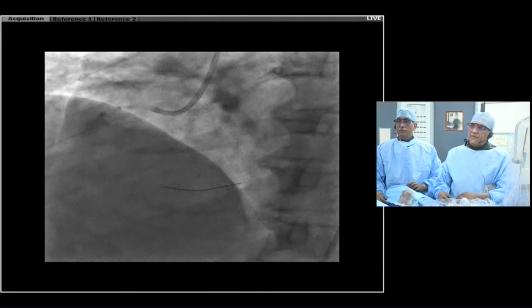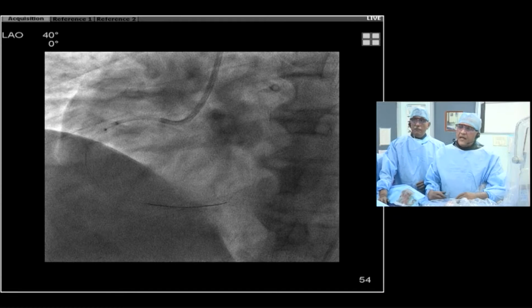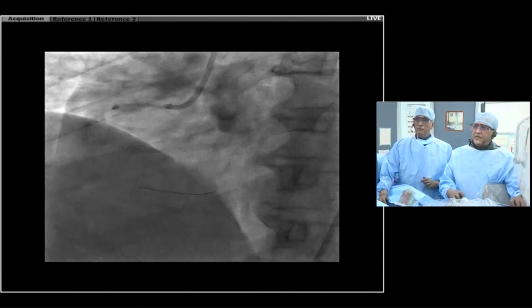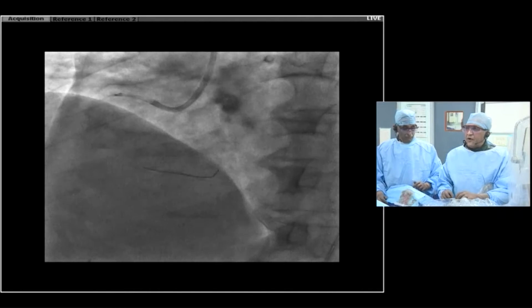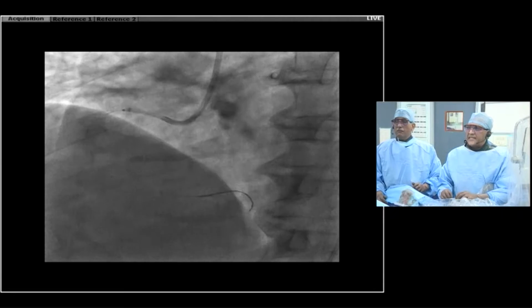We don't keep the same wire at that level. And you saw I manipulated my guide as well, repositioned my Guidezilla. All this is very important because the laser emits a huge amount of energy at that tip, you know. Though it's only 50 microns, it's quite intense.